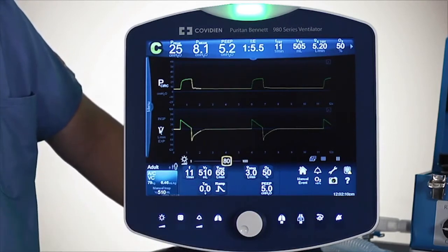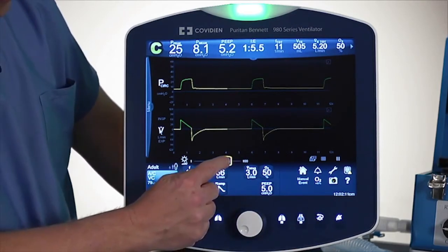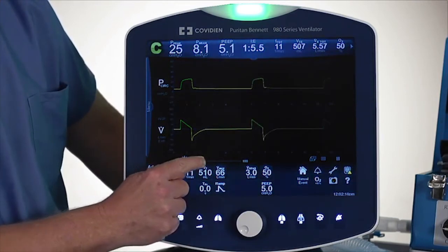The first one is the actual brightness. If I touch that, I can use my fingers and change how bright or how dim the screen is.